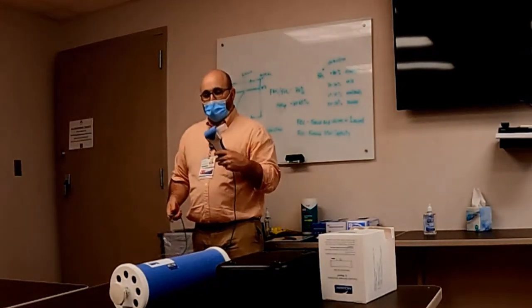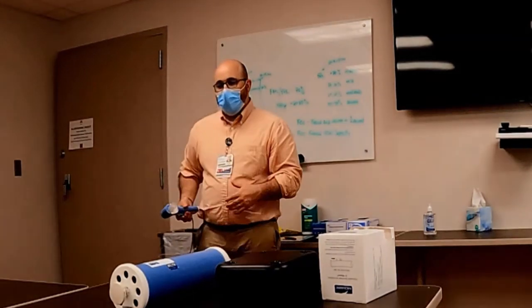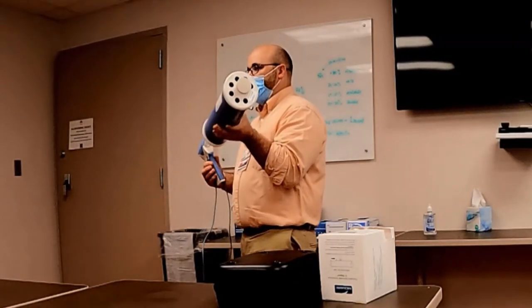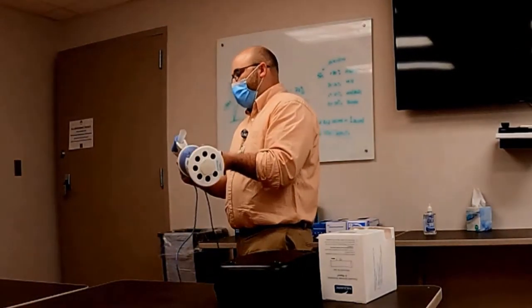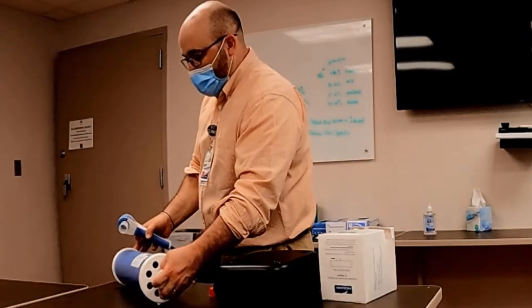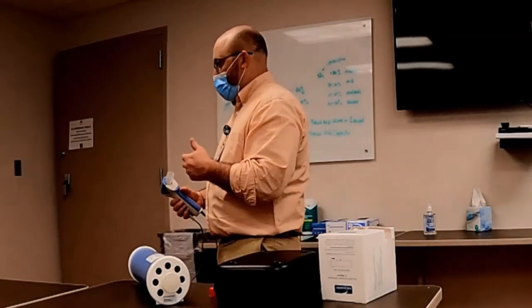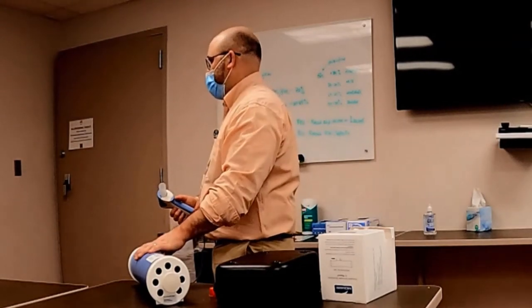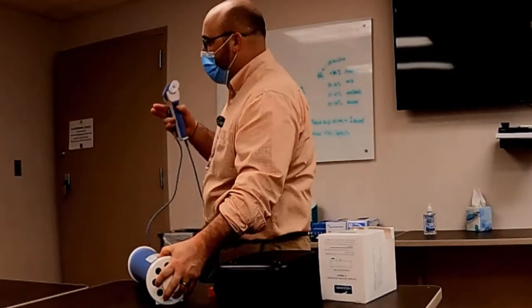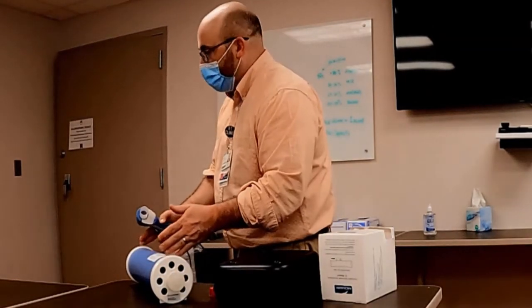So we plug it in, and the first part that it may ask you to do is a calibration. Calibration is very, very easy, and we use this 3 liter syringe. So this is exactly 3 liters in here, okay? It has a cap on it, and the machine will talk you through every bit of this. Now, I did talk to one of the practice managers, and she didn't know what the frequency of doing the calibration is, so it might be once a month, might be once a week, might be once a day, might be for every test. It's extremely easy. They'll tell you on the screen what to do. This is just a big plunger, but it's exactly measured out 3 liters.